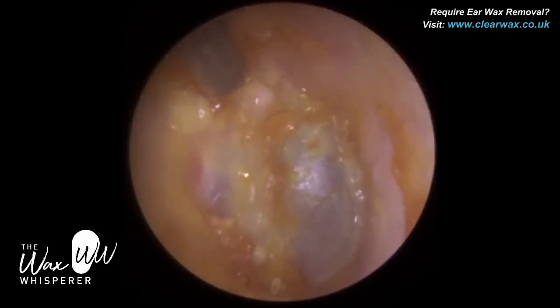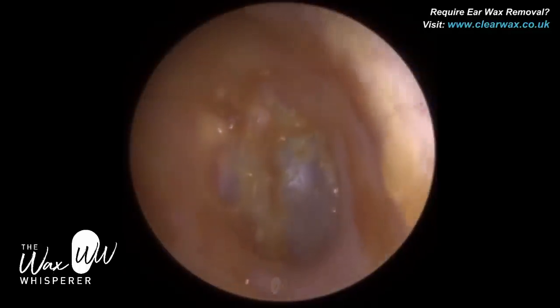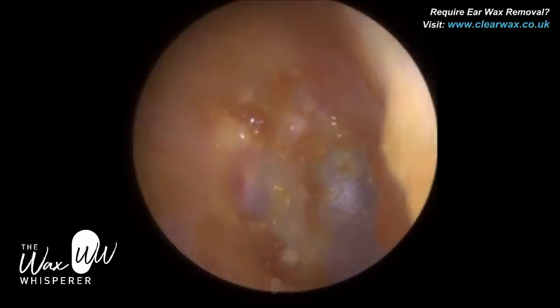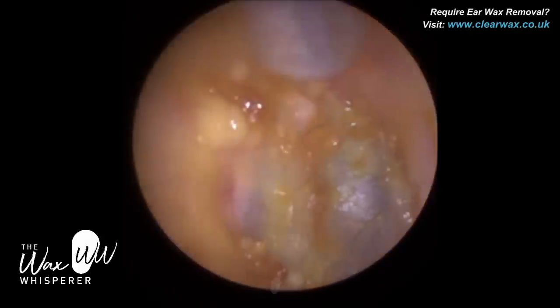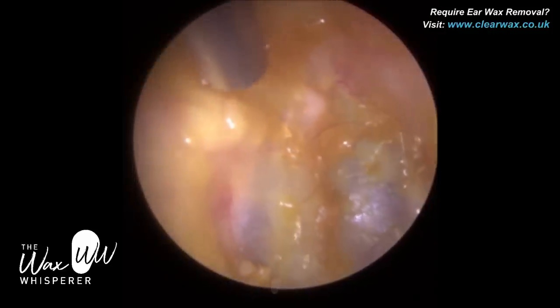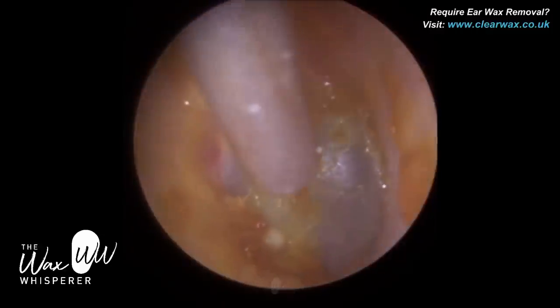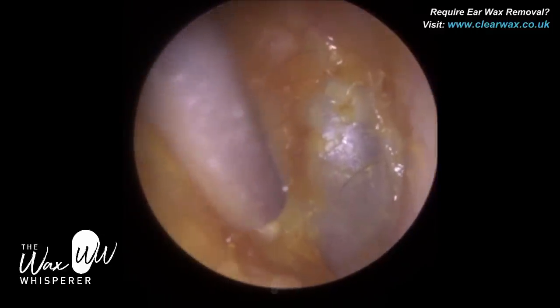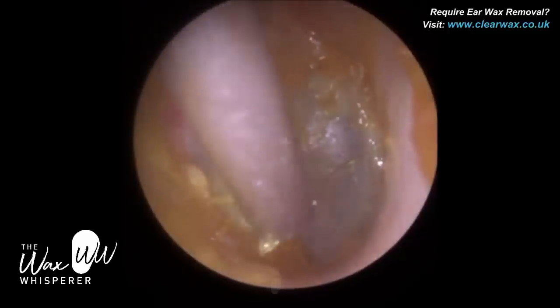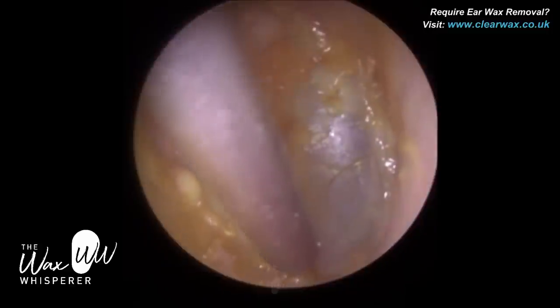So I'm just on the back part of the eardrum here — medically we'd call that the superior posterior quadrant, or using a compass, that's northwest. The fine-end just got blocked so it came out of the ear. Again, just trying to avoid contact, just hovering over the wax. We've got some wax here at the base inferiorly in the annulus region.